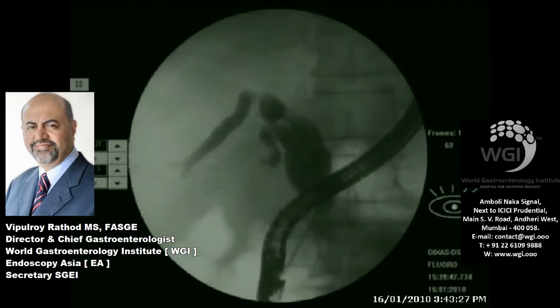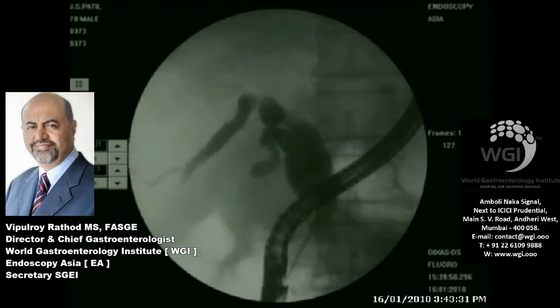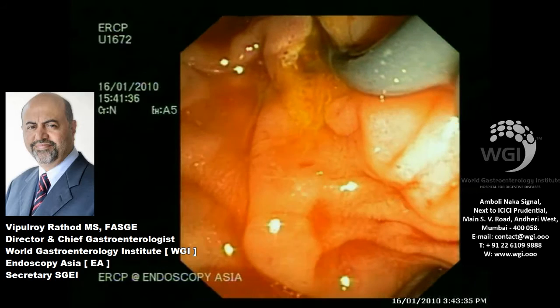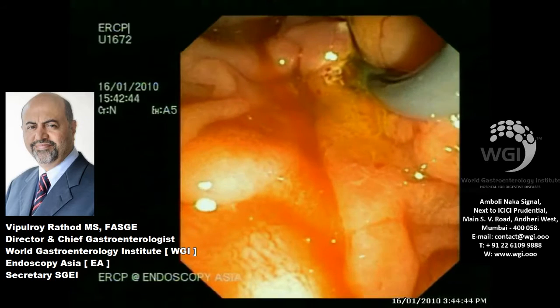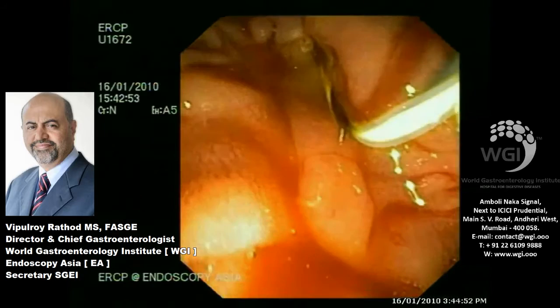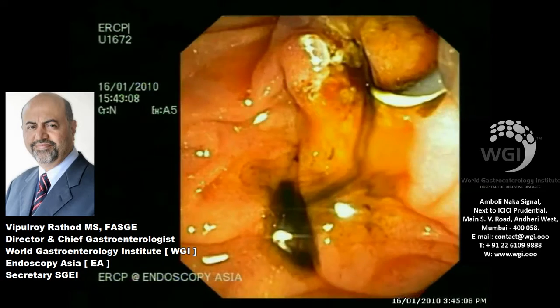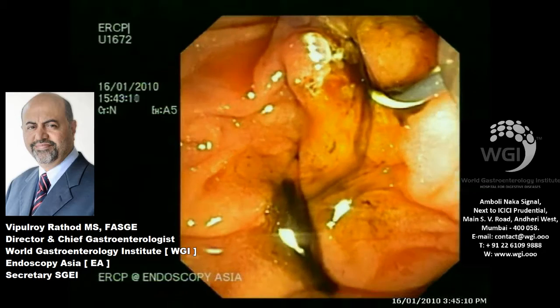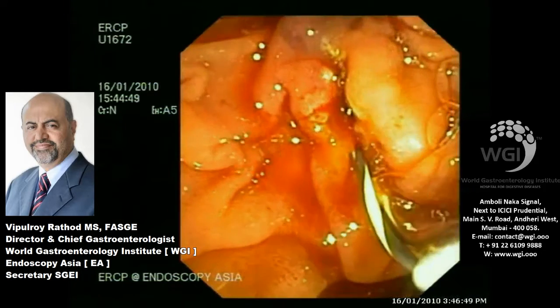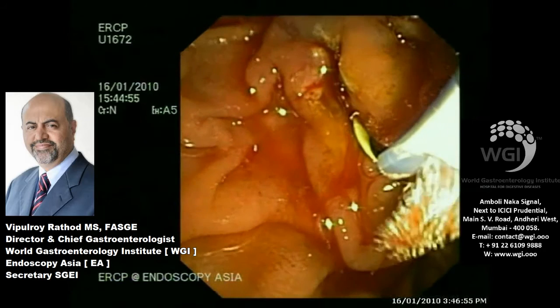We are evaluating the stricture also. You can see the lower bile duct completely occluded with the neoplastic process on cholangiogram. And then we exchange the Terumo for a stiffer guide wire once we have obtained a cholangiogram. So this is our standard practice. You can see dark bile coming out. Now this patient, as you can see, has minimal free fluid. You can see the brush.